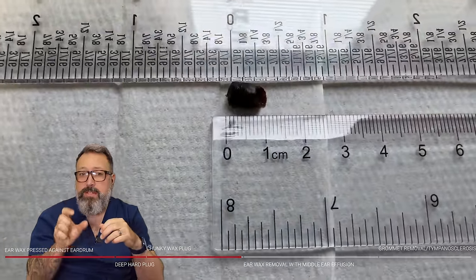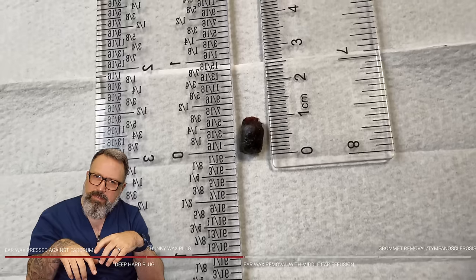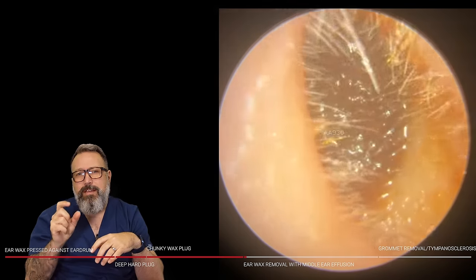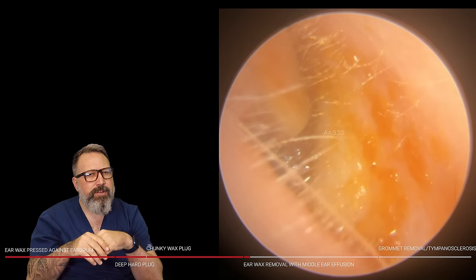This plug is just under one centimeter — three eighths of an inch, I think. Let me get my glasses back on. This is the fourth patient in the compilation video. You can see a very narrow entrance to this particular canal, with a much softer type of earwax. As soon as we're putting the suction tube on, you can really see it all almost imploding into the suction tube.